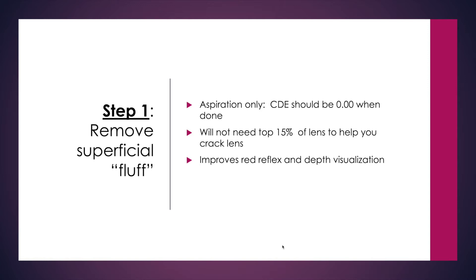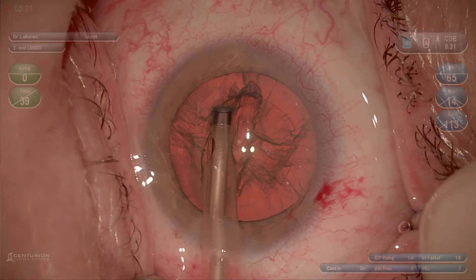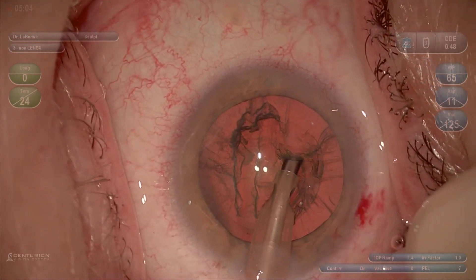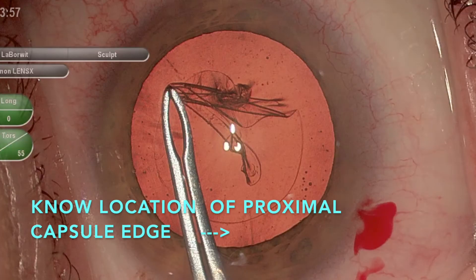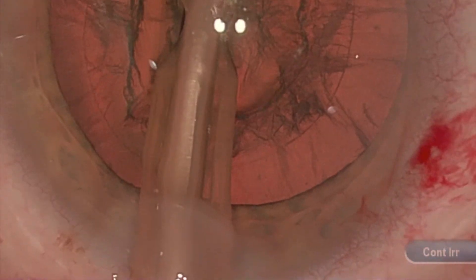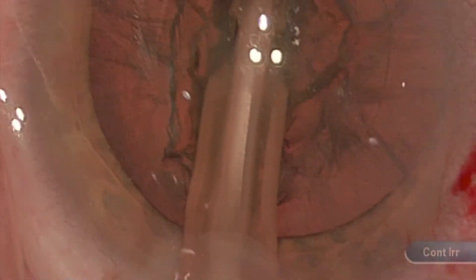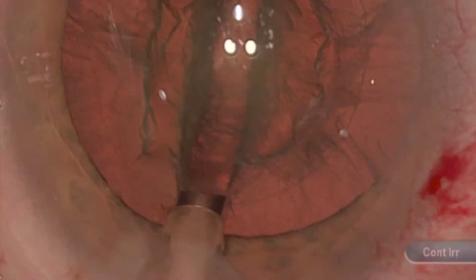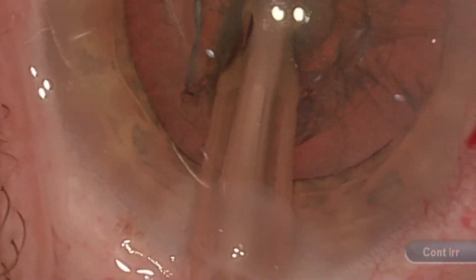This step will help you improve your red reflex and visualization during the groove steps. This demonstrates removal of the superficial cortical material so I can get better visualization for the groove. Step two is to then begin at the edge of the proximal capsulotomy—take a visual note of where that location is—and angle steep, because the proximal third debulking is the most critical part. You can see that I'm at the edge of the capsule and going deep into the deepest area of the cataract.